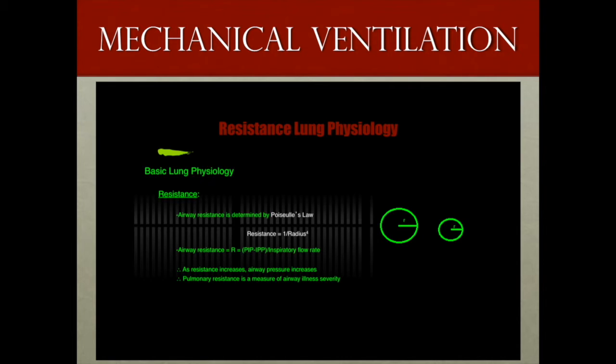So a patient who has bronchospasm and has increased airway resistance, if this patient is given a bronchodilator, and subsequently if their resistance improves, the bronchodilator has worked. However, if the resistance has not improved, then the bronchodilator has not been an effective therapy for that particular patient, and a different therapy may be indicated.